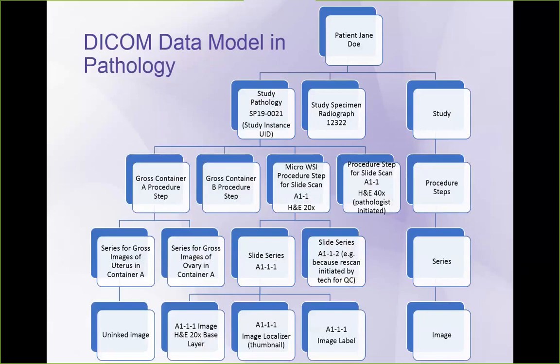There are a lot of examples that we'll be putting into the text to provide clarification on how this would work moving forward, so that there's some clarity across all vendors on what elements of the DICOM image file format need to be leveraged in order to support the workflow and the transactions for IHE interoperability specs. Next slide.